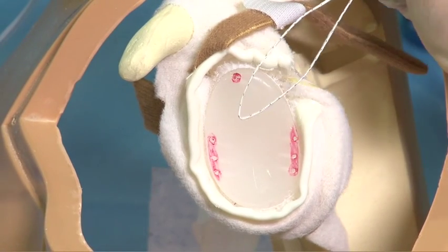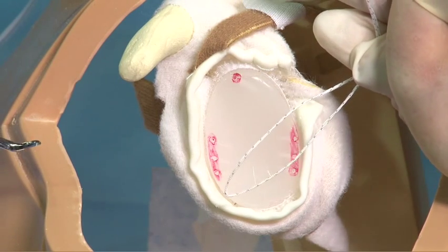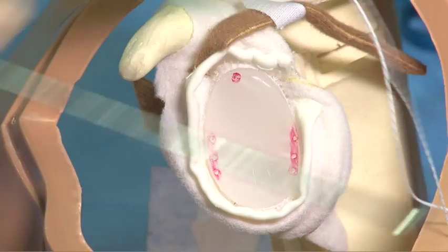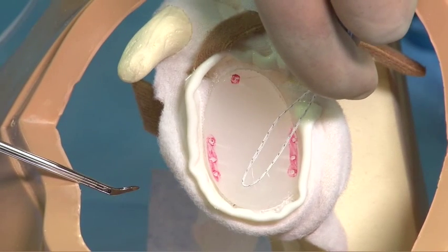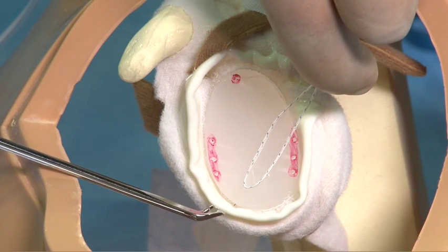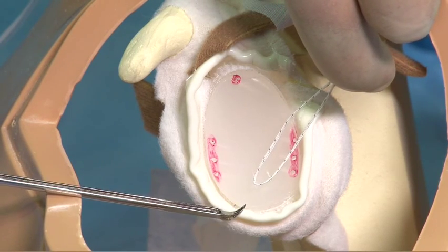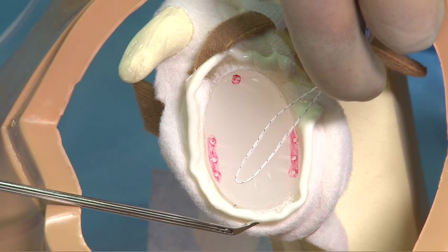The benefit of the six-ter device is that it allows for tissue to be penetrated at the six o'clock position on the glenoid. We can see that the six-ter has a jaw on the inferior edge, and as we penetrate through at the six o'clock position in the labrum, we can then retrieve any suture from any anchor-type device.